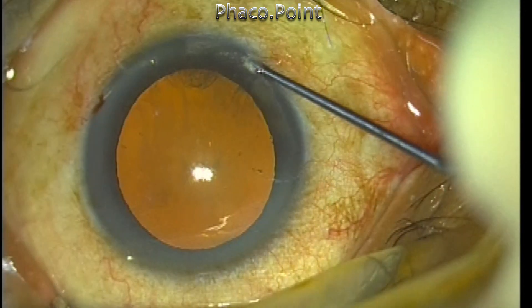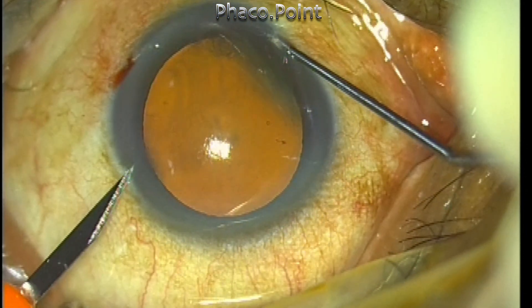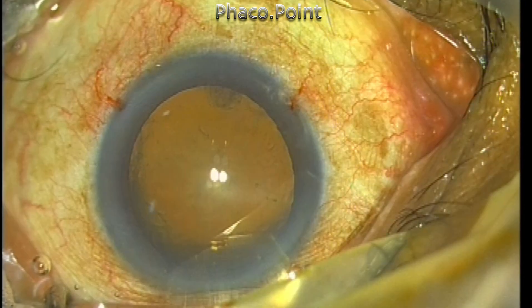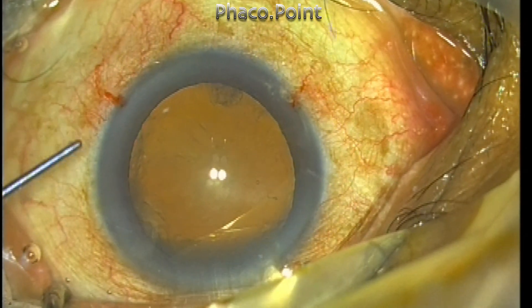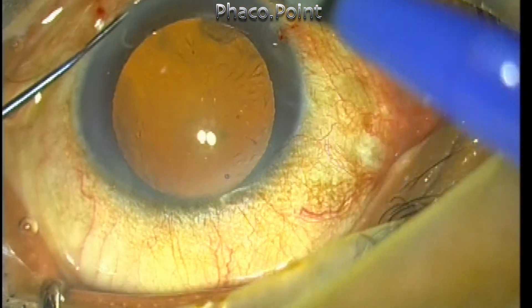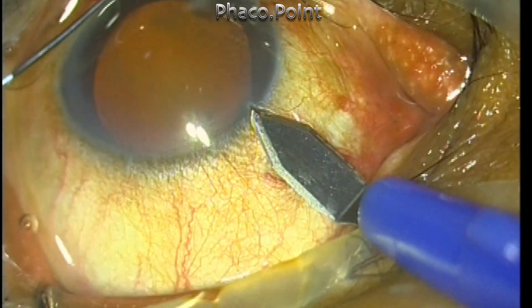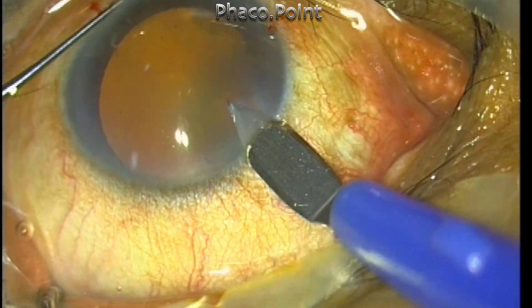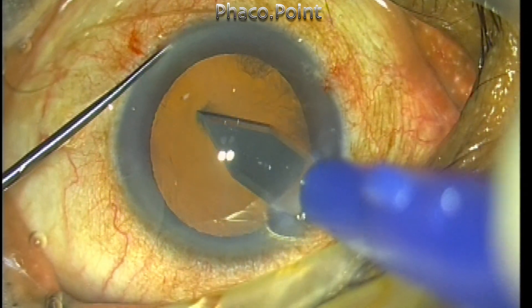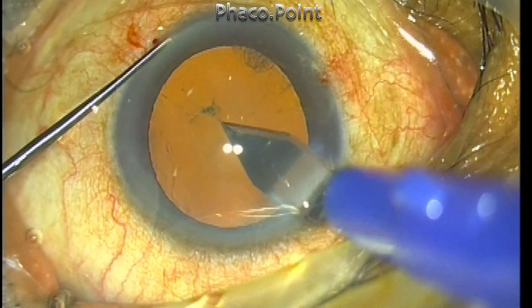Two such incisions are made at 5 and 7 o'clock positions. The 7 o'clock pocket is used to create fixation to make the side port incision. Once this is done, the 5 o'clock pocket with a rod passed through it gives a firm yet gentle tangential hold of the cornea, which can be used to create the clear corneal incision. I make a small opening in the anterior capsule to facilitate the tear with the capsulorhexis forceps.